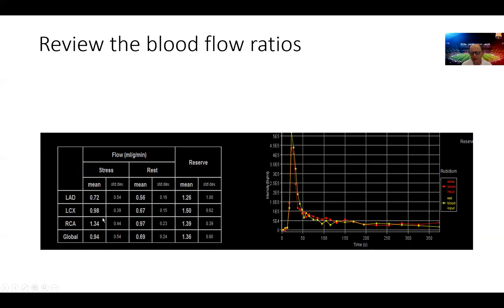But there is a failure of augmentation of flow in the stress images specifically in the CIRC and LAD where we can see these mean flows well below our cutoff of 1.8 in all segments but predominantly in the LAD where we identified ischemia and some in the CIRC and the RCA too.